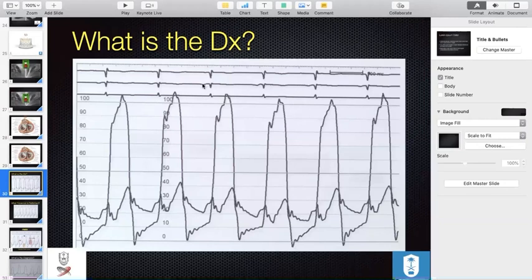tiny P waves. So you assume you need to have an A wave, and you're going to see that. And you have no extra beats, whether atrial or ventricular systoles, so it's not going to disrupt your pressure tracing analysis. Because once you see it, it might disrupt or might help you in pathologies like hypertrophic cardiomyopathy, which is in another case.